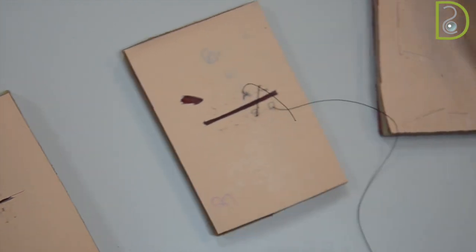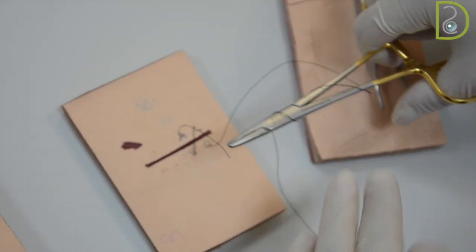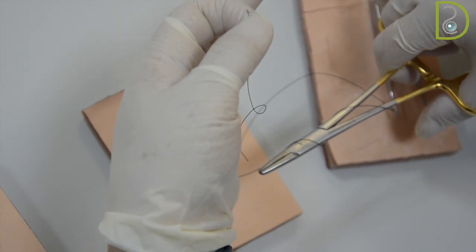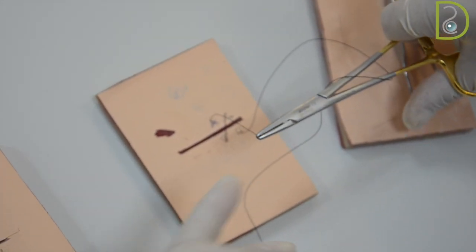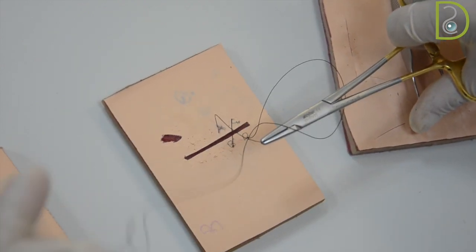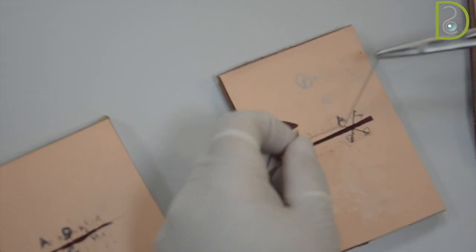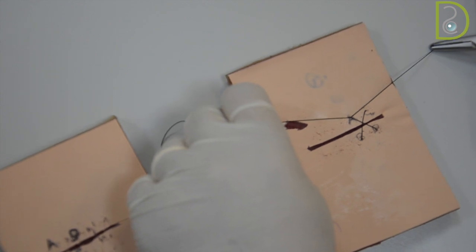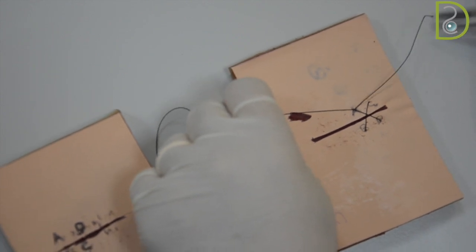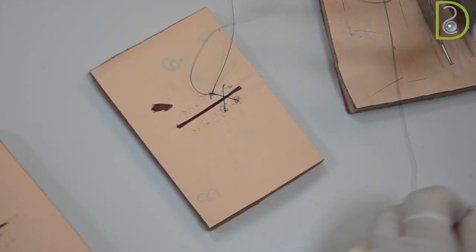Then you start closing the loops. One time you will take it clockwise, holding the tail from the tip so that it will not get grasped. Slowly adjust your knot at the buccal surface — whatever you choose, buccal or lingual surface — then one time anticlockwise.